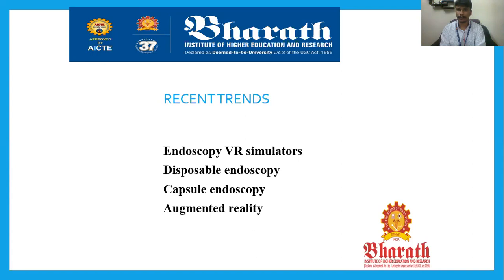And capsule endoscopy. Capsule endoscopy means a camera with light and recorder is sent inside a capsule. The capsule goes into the small intestine and captures the whole internal organ, and it is then excreted through the excretion system of the human body.